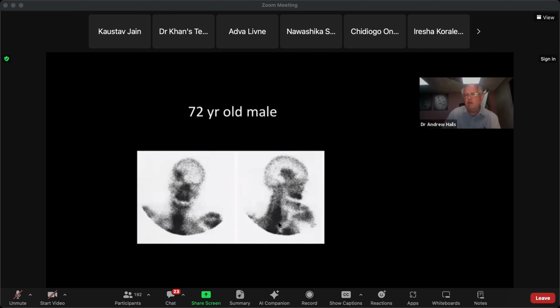You also quite frequently get a bit in the thyroid gland, a bit of free pertechnetate going to the thyroid gland. So yes, other than identifying there was an abnormality, you'd have to correlate it with something else. Any idea what kind of things might cause something like that?